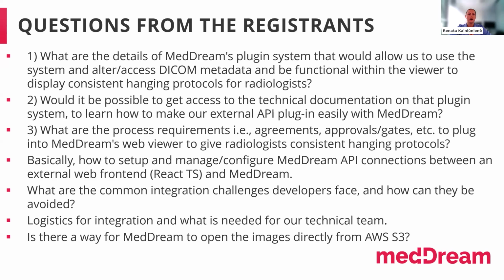Next one, what are the common integration challenges developers face and how can they be avoided? I would say maybe failing to read all the documentation and not setting up the demos, because this demo is really good.